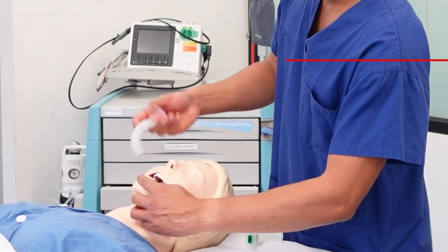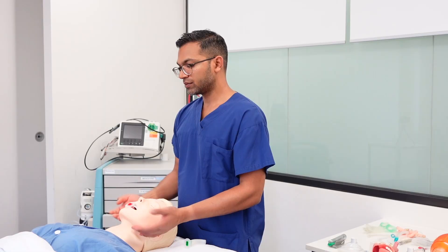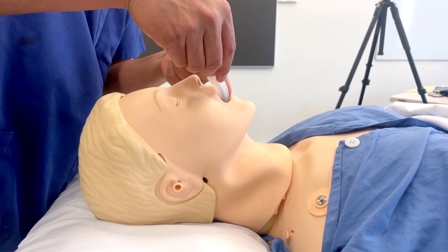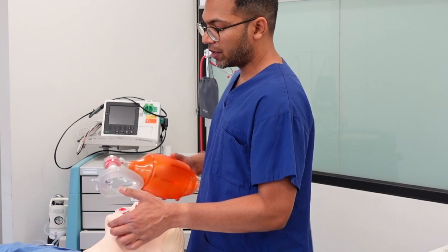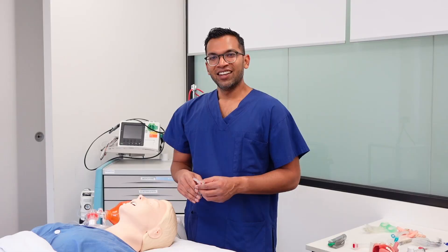The insertion technique is interesting: place the Guedel in backwards — facing upwards — to get past the tongue efficiently, then rotate it as you go down. Once the peak curvature is at the lip, curve it around until it sits right behind the tongue in the correct position. At that point, it's relieved any obstruction around the tongue and you can apply the mask with a CE grip and ventilate the patient.